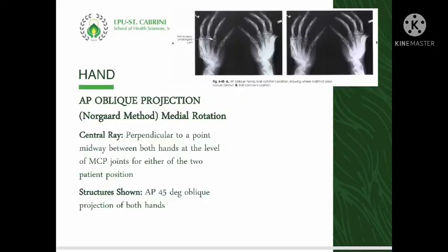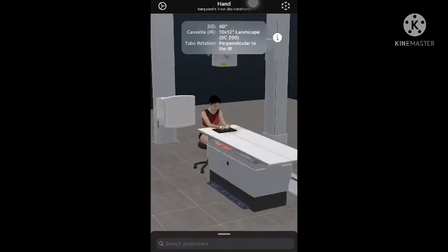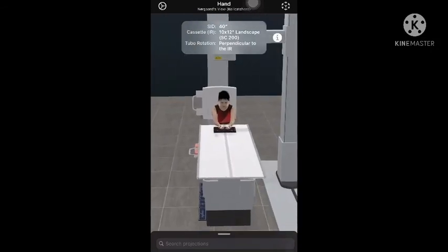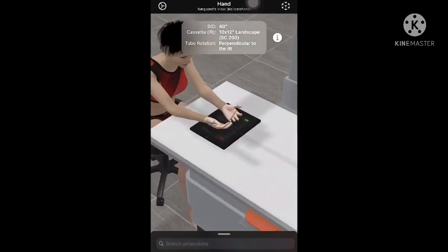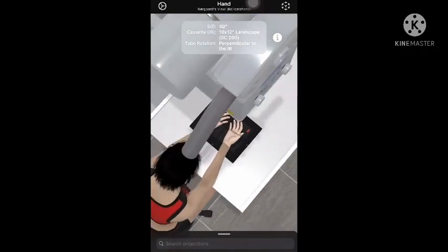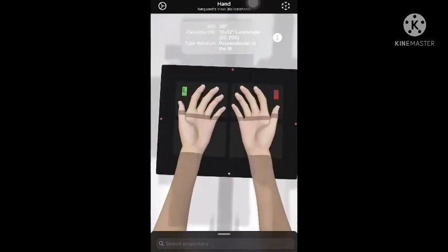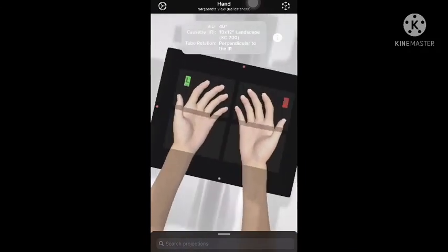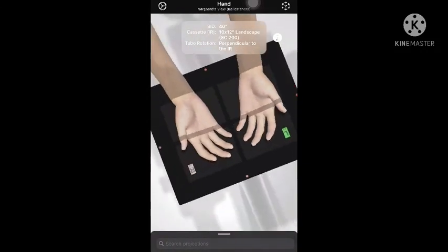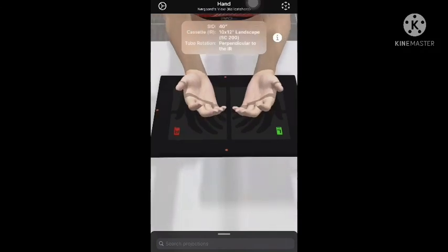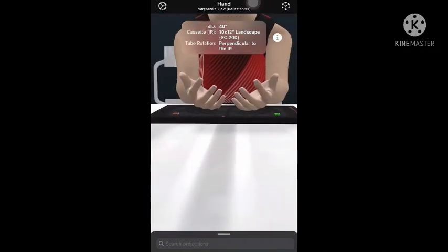The central ray is directed perpendicularly to a point midway between both hands at the level of the MCP joints for either of the two patient positions. The radiograph will show a 45-degree AP oblique projection of both hands. The patient is positioned at the very end of the radiographic table, with the hand in oblique position at a medial rotation of 45 degrees. As you can see, the fingers are cupped as if the patient will catch a ball, and the central ray is directed at a point midway between the MCP joints of both hands.